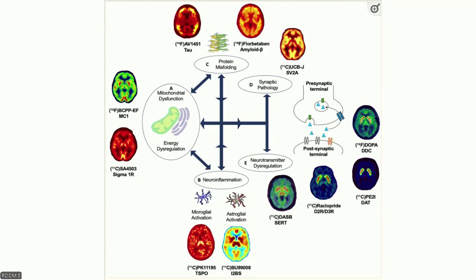And then we can look at eventually hypometabolism or hypermetabolism in certain regions. And this is done by calculating the standardized uptake value ratio. So not only we must quantify the uptake of the tracer voxel by voxel, but we also need a reference region, because actually it's not a quantitative measurement that can be compared across subjects. I might have, on average, a higher uptake than another person. Also, older people might have, on average, a lower uptake compared to younger people, and so on and so forth.